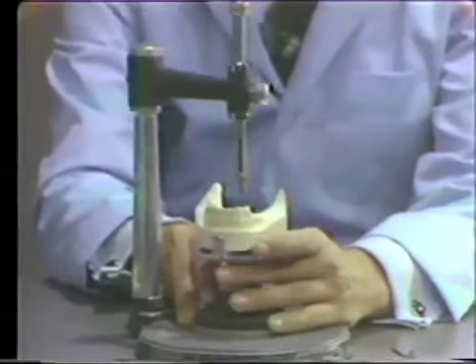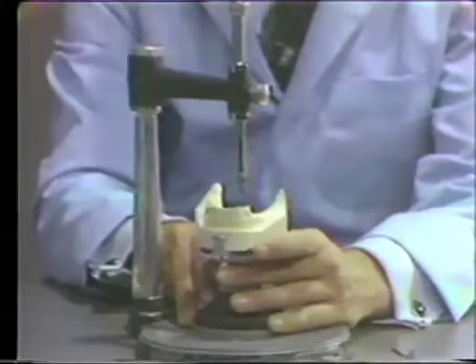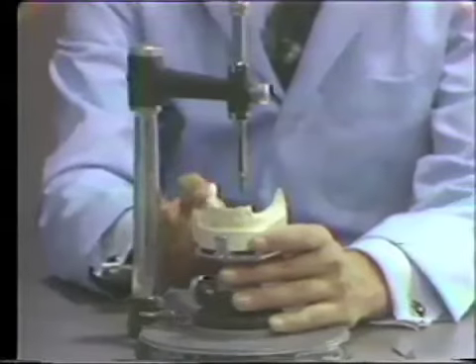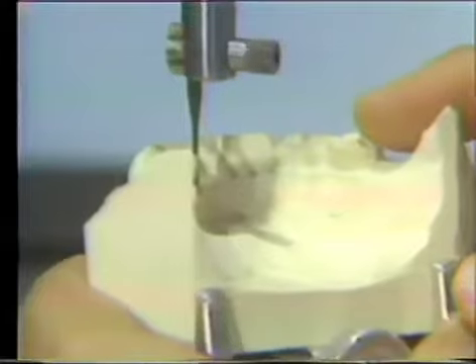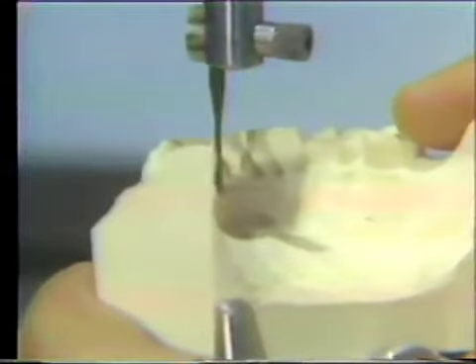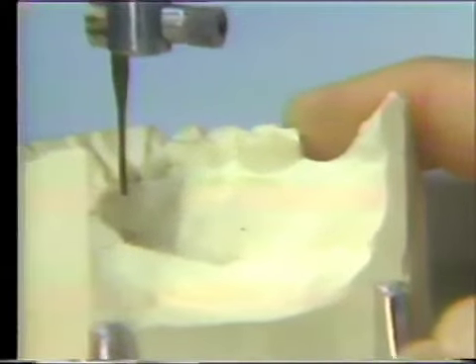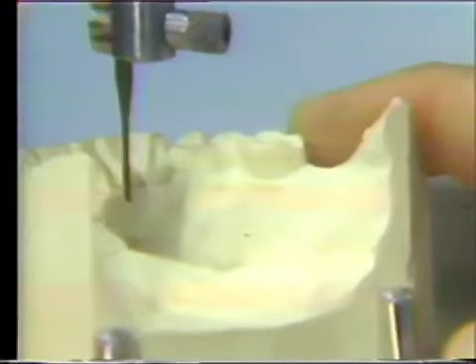We have to also keep in mind our findings on the oral exam. Now, we found on the oral exam of this patient that the remote molar abutment, potential abutment, has a restoration on it. And this restoration was faulty, and it was going to necessitate crowning with a full gold crown.